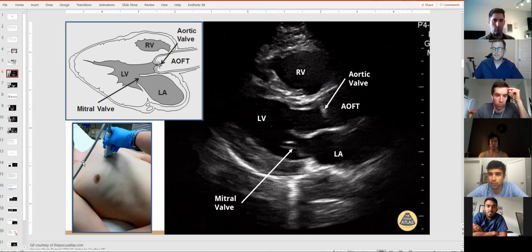Similar to when you're doing central lines, etc. By convention, it's going to be pointed to the right shoulder. And you'll see a small little P or a circle or a white thing up where the reference point is that works or shows similarly to what the probe marker is. And by echo, by convention, it'll be in the top right corner here.